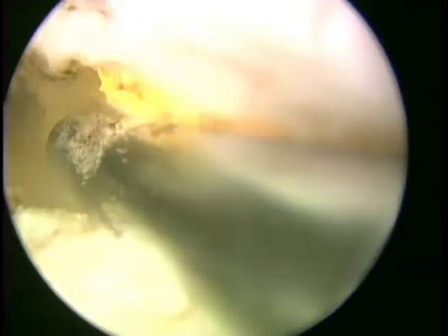Now, this patient has been on a 5-alpha reductase inhibitor for quite some time, and especially in this area, you can see how much stiffer the tissue is. It does not respond as well as the initial vaporization, and this is simply a composition issue of the heterogeneity of the prostate. There are certain areas that are more dense, more stromal, less vascular, and will take a little bit more time and repetition over that area to create the tissue defect we're looking for.